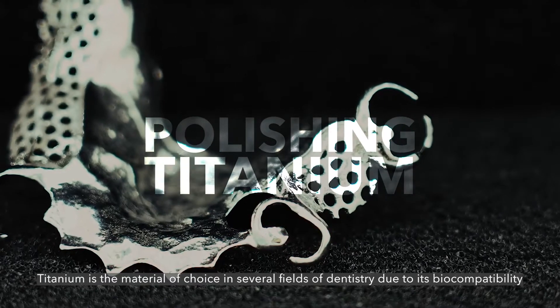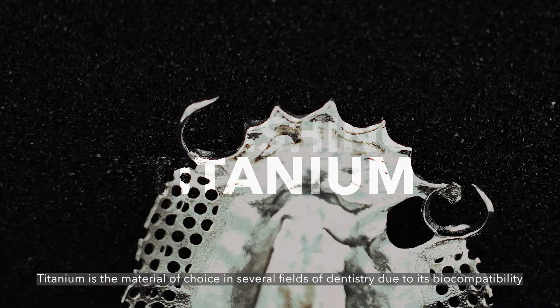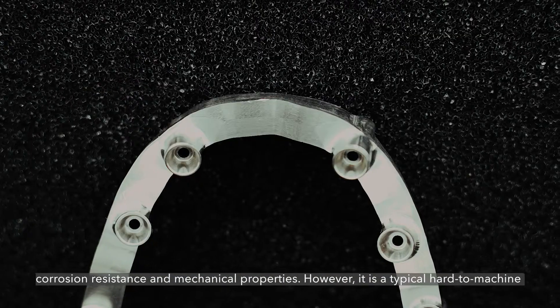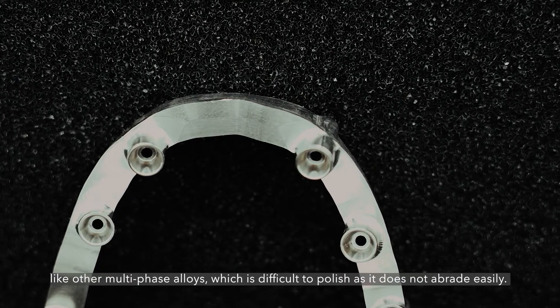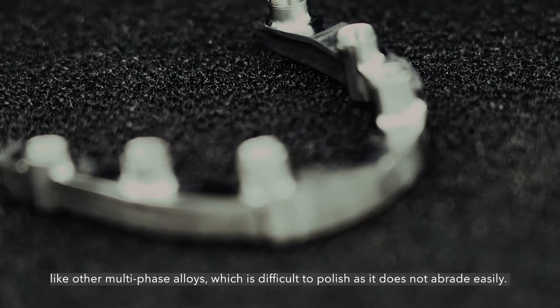Titanium is the material of choice in several fields of dentistry due to its biocompatibility, corrosion resistance and mechanical properties. However, it is a typically hard to machine material like other multi-phase alloys, which is difficult to polish as it does not abrade easily.